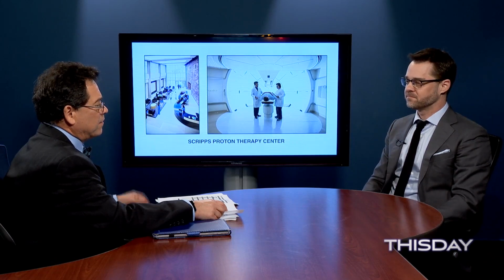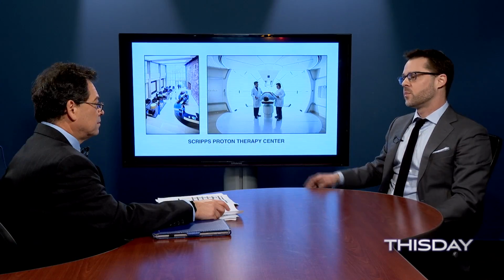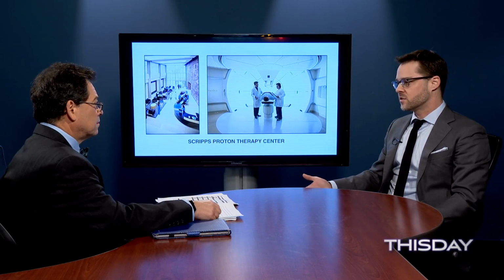Yeah. And as far as the quality of life during treatment, we often hear of radiation therapy, chemotherapy, the people, among other things, just feel very, very down and lethargic and so on. So how does this differ? Yeah, well, the treatments, whether you're talking about surgery or chemo or radiation, the effects really depend on what part of the body you're treating and what cancers. And with proton therapy, probably the most common cancer we see is prostate cancer. And in gentlemen with prostate cancer, the treatment's very, very well tolerated. They're able to continue with working at their jobs usually, or working outside of the house, playing with their children, their grandchildren, playing golf, being active outside. So there's really no limitations that we impose on those patients. But across the board, the difference in side effects really depends on what part of the body that you're treating.